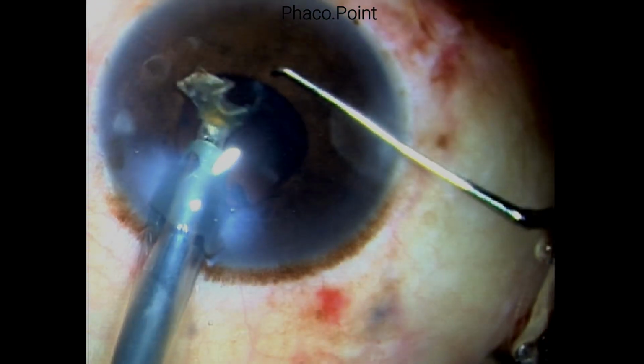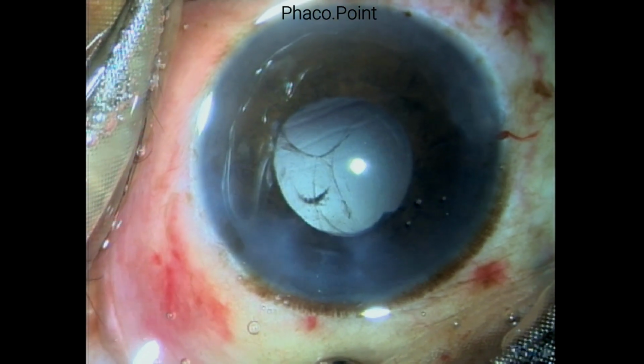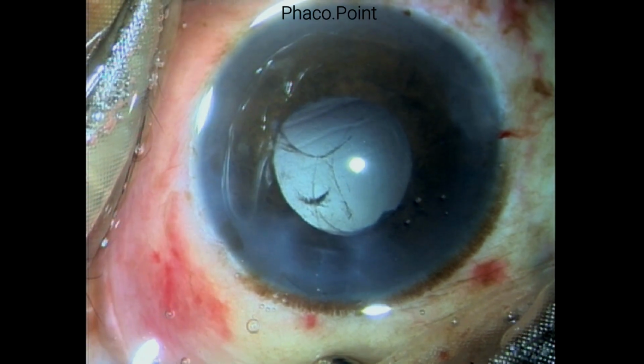At this point, it is extremely important not to chase the fragments on its way down, because that could cause significant damage to the posterior segment. I let the fragment fall, perform a viscofluid exchange, and then bring my instruments out of the eye.